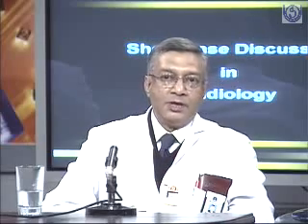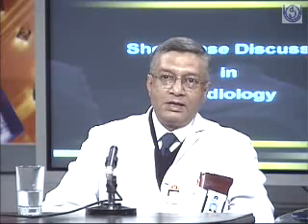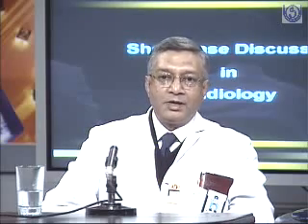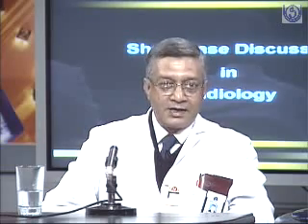Okay. Besides this, can I add? If there is a contrast study involved in any part of the body, whether it's a barium study or an IVP with iodine contrast, it's always nice to do this plain X-ray that Dr. Rajiv is mentioning, for another reason, what we call a scout film. It helps the radiographers to set the correct factors, so that once the contrast has been given, you are not meddling with contrast factors.